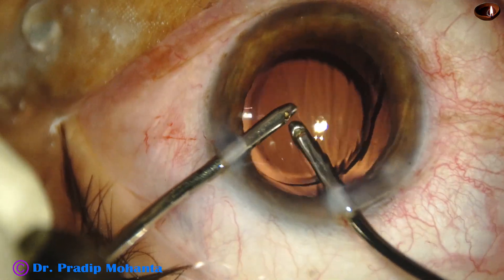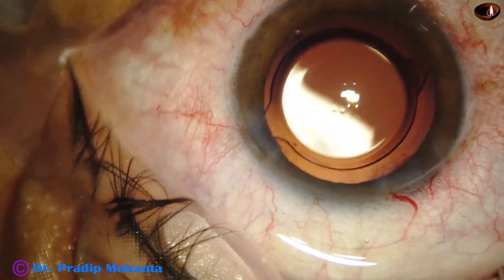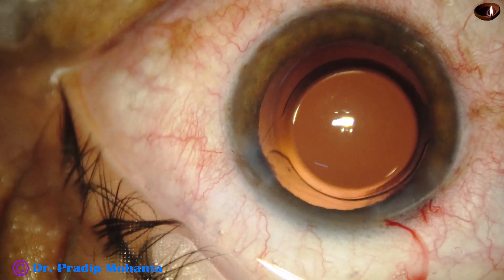And all the visco from the anterior chamber, anterior chamber angle, everywhere — wherever there is viscomaterial — must be washed out. This is a bit of moxifloxacin.